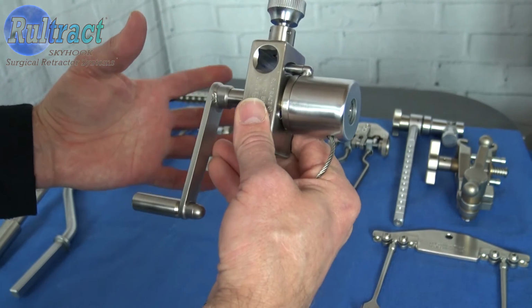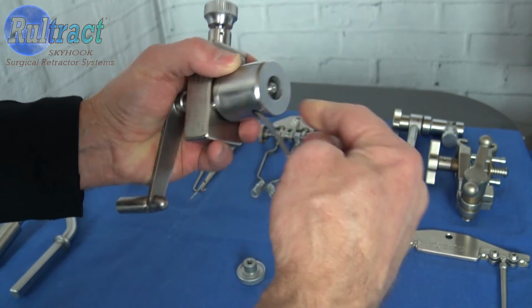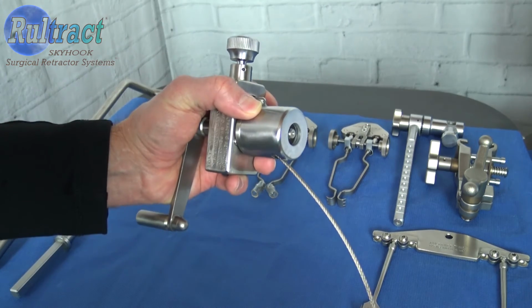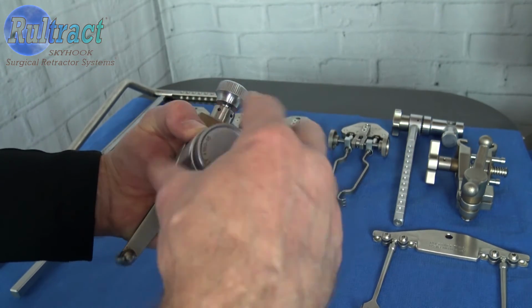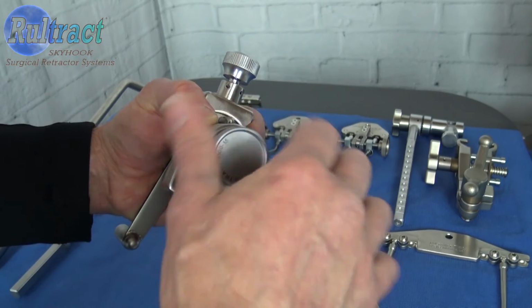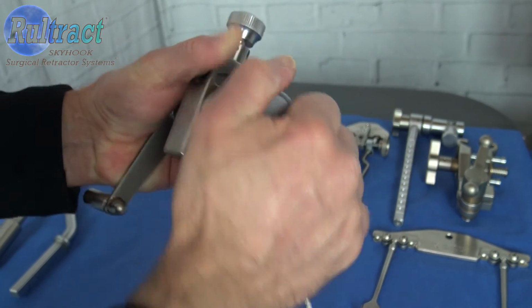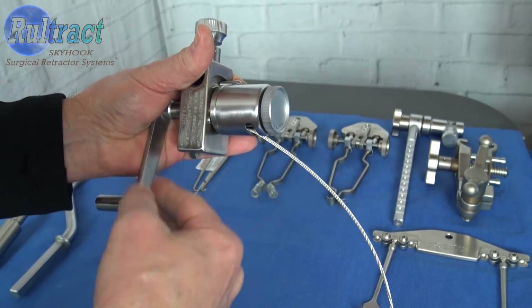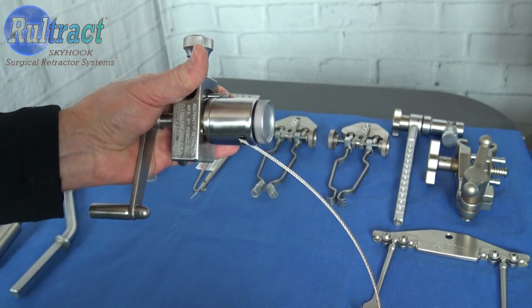Next, we're going to put the spool cap nut back on. So you want to make sure that you're holding your ratchet assembly by the handle, because if you're not, when you're trying to tighten your spool cap nut, the handle's going to turn. So hold it like this. Go ahead and put your spool cap nut on by turning it clockwise. You don't want to use a tool, just hand tighten it as tight as you can get it. So now your ratchet assembly has been completely reassembled, and we are ready to wind the cable into the spool.